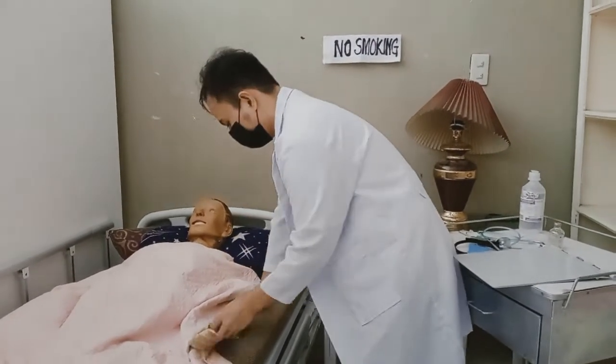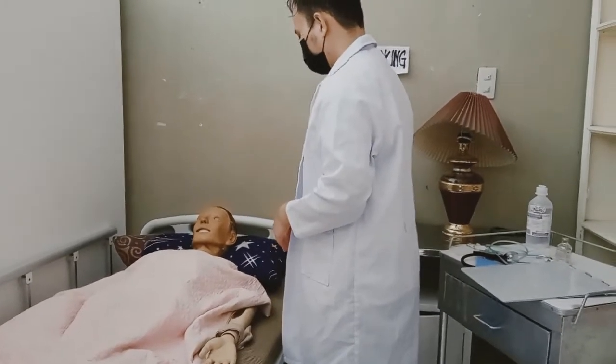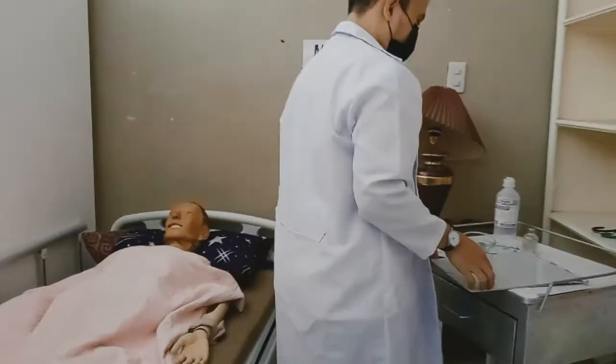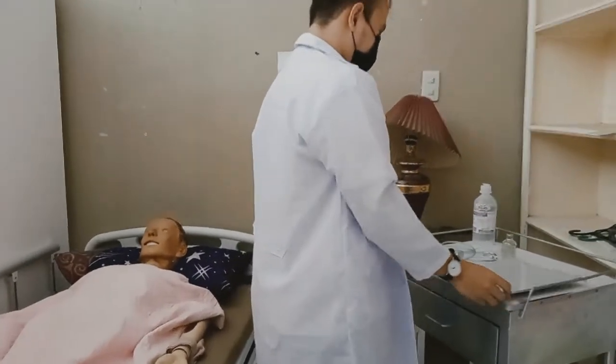Check the patient's allergy bracelet. Ask the patient about allergies. Explain what you are going to do and the reason for doing it to the patient. Scan the patient's barcode on the identification band if required.